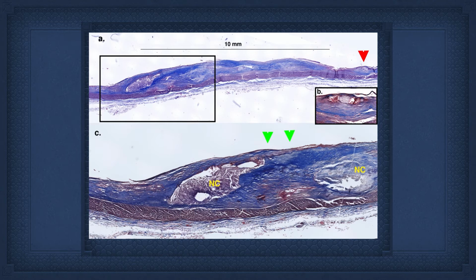So you look at that on the left in the black box, that necrotic area. Now that necrotic area where the green arrows are goes up and into an area that's PIT, and there's PIT along the length of here, along with necrosis. And the red arrow to the right just shows a TCFA with no long necrotic core. And I'll get into that point in a minute.